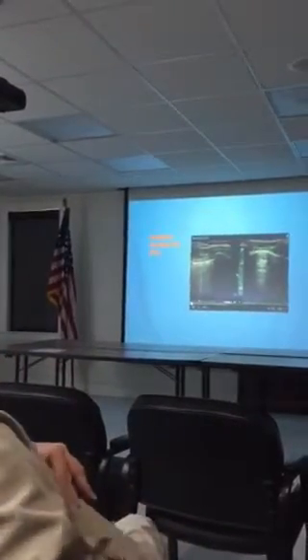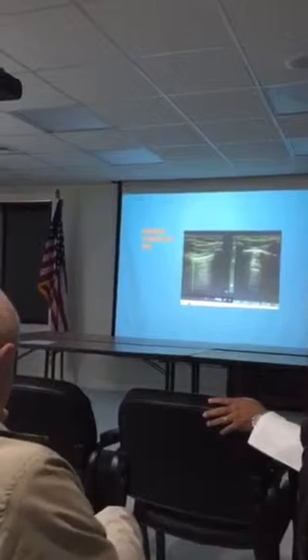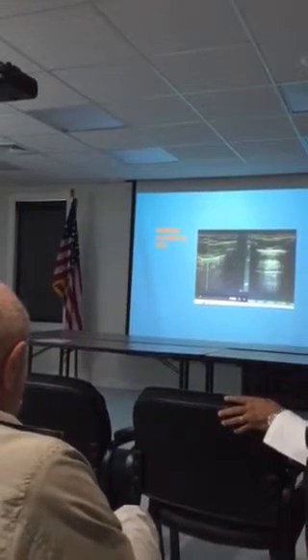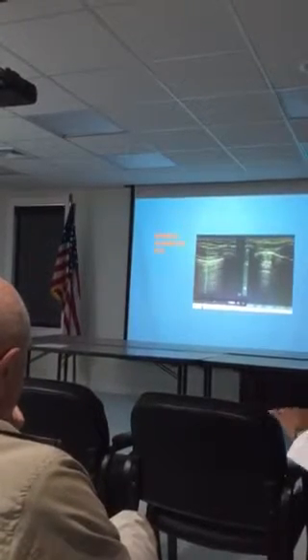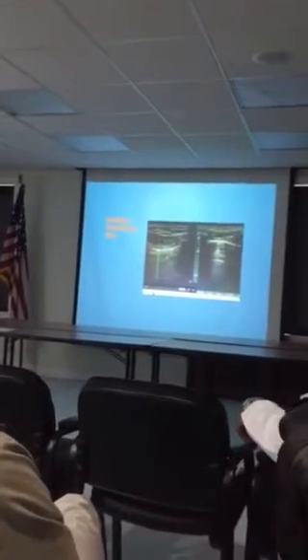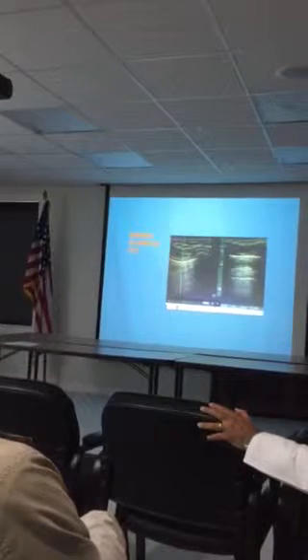The normal study here. This is the pleura here, and these are the inferior ribs. You see everything is moving. These lines are perpendicular, triangle shapes. They come from here, they're called comet tail lines. And then this one on the left side is positive. You see it's bulging, convex here. This is pneumothorax here. There's not much movement of the lung.